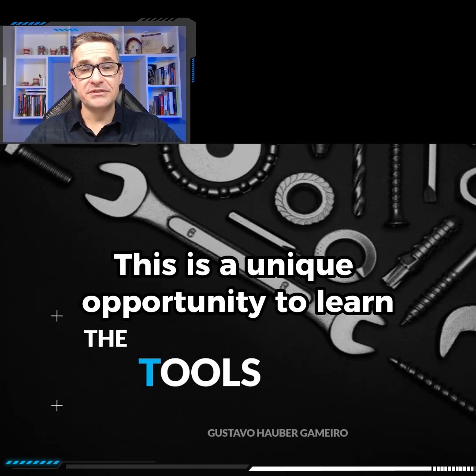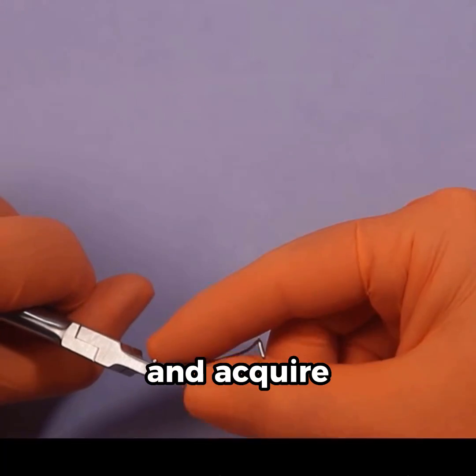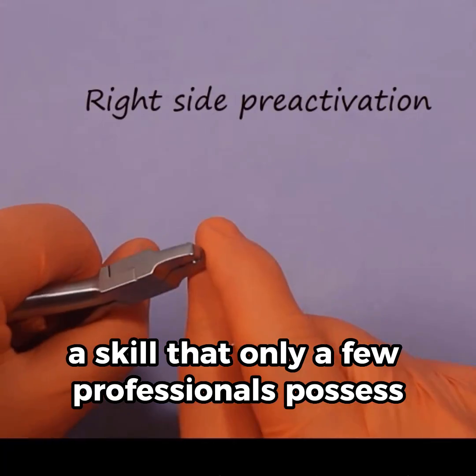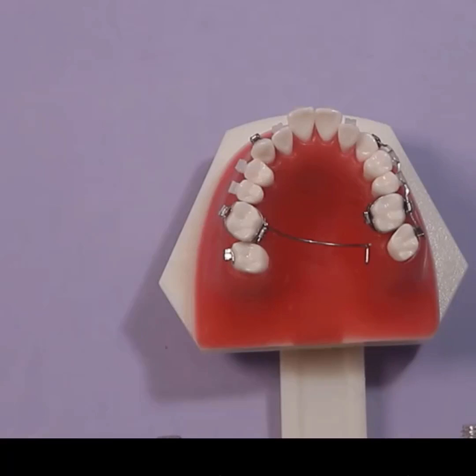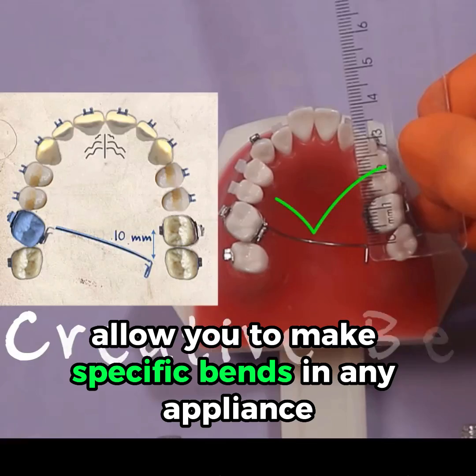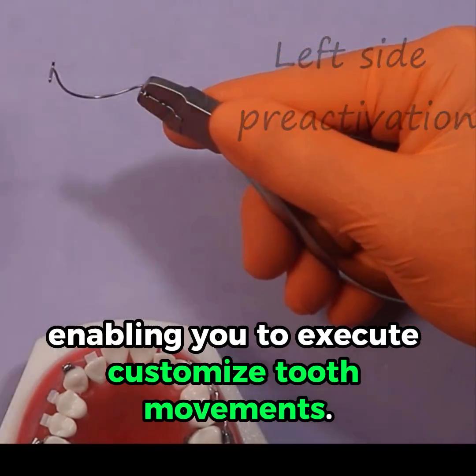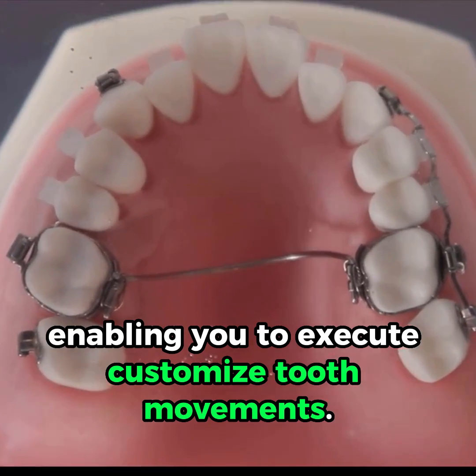This is a unique opportunity to learn the segmented tools of orthodontics and acquire a skill that only a few professionals possess: the ability to perform creative bends. Creative bends allow you to make specific bends in any appliance, enabling you to execute customized tooth movements.